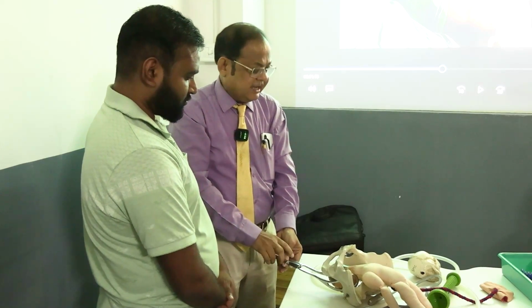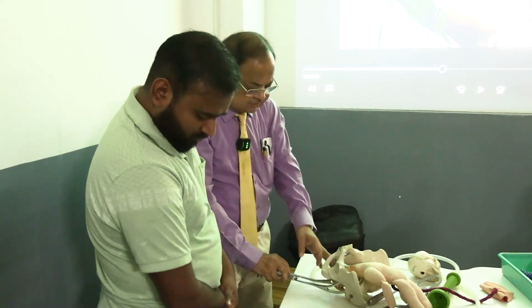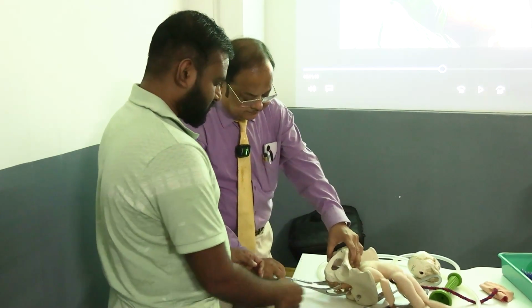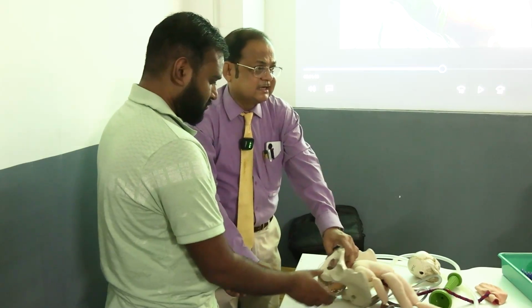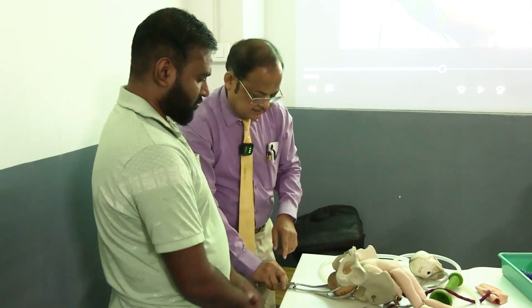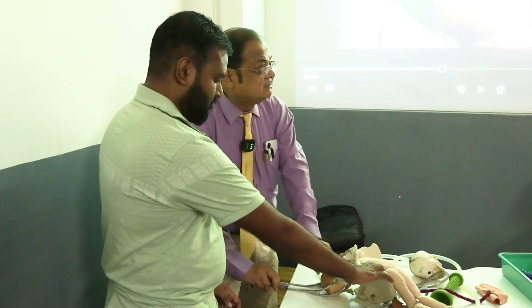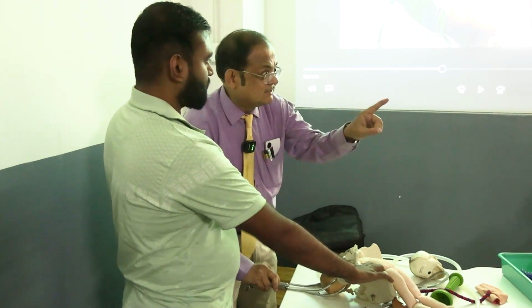And in case of low forceps operation, there are two types mainly used. You will give low forceps operation with three types of traction. First is downwards and backwards, because in the mechanism of labor, the subocciput comes up under the symphysis pubis.